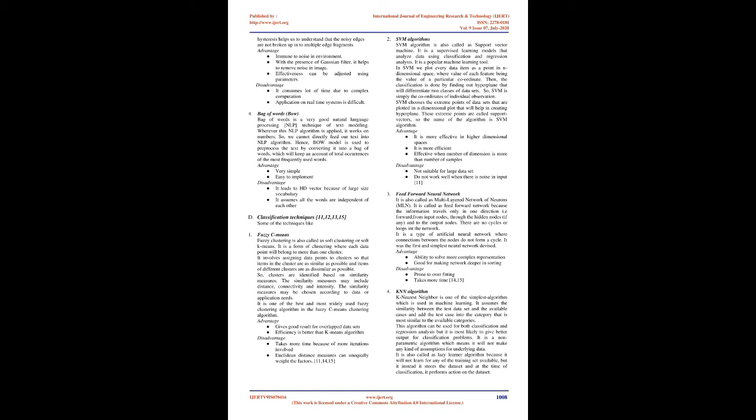Textural properties can be calculated to know the details about the image. It is a statistical method which is based on the gray level value of pixels. Disadvantage: seed selection is more difficult. Execution time is high, and more.